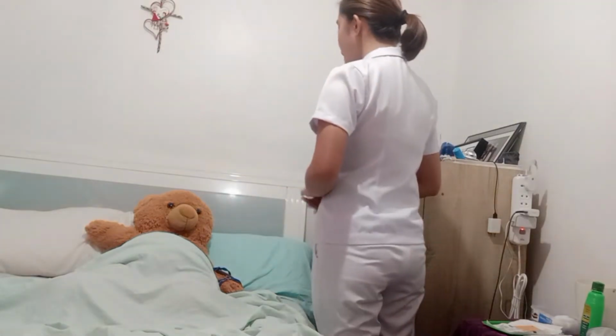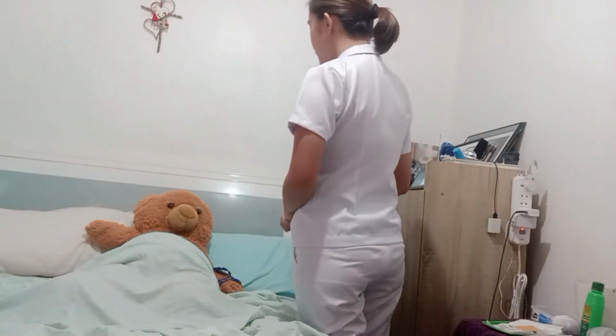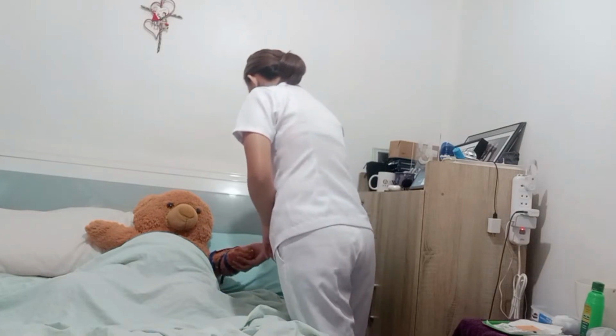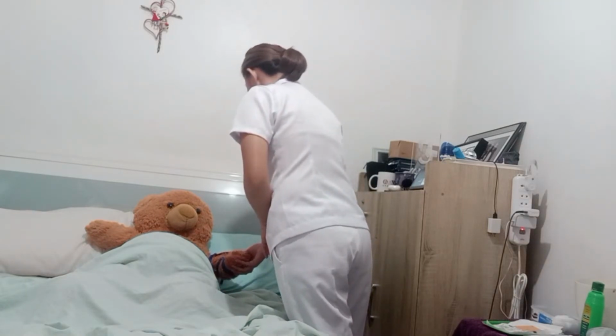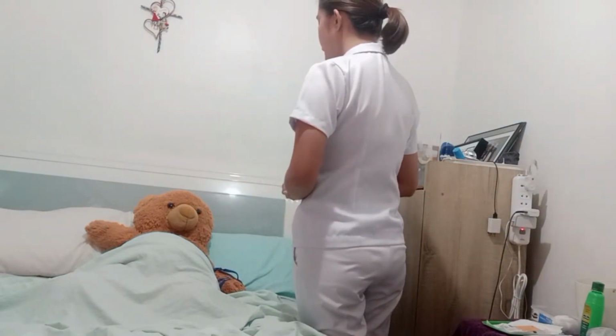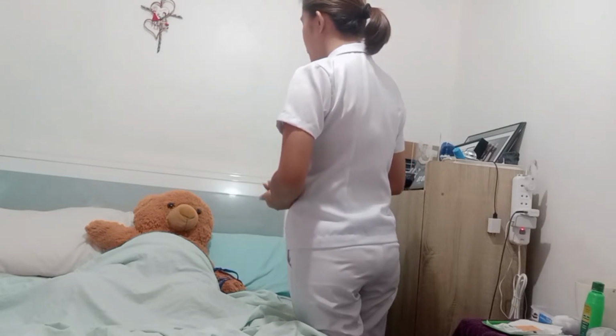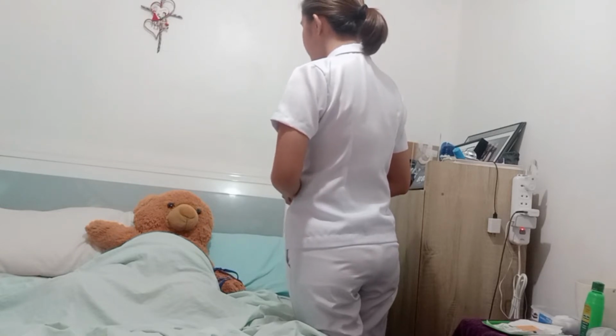So now I have to introduce myself and verify the client's identity and explain the procedure to the client. Good morning, ma'am. I am Jasmine Madasudanya, your student nurse from Davao Doctors College. May I see your wristband, please? Kindly state your name and birthday. Thank you. So, ma'am, Dr. Strong has ordered a skin test, which means that I have to inject a minimal amount of medicine to your skin to identify any allergens to which you may be hypersensitive. Will that be alright with you, ma'am?